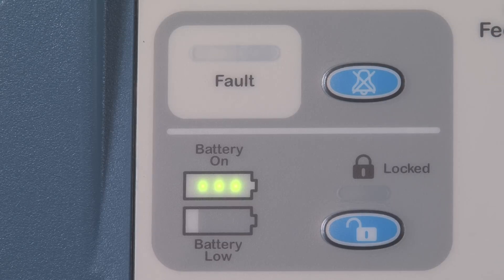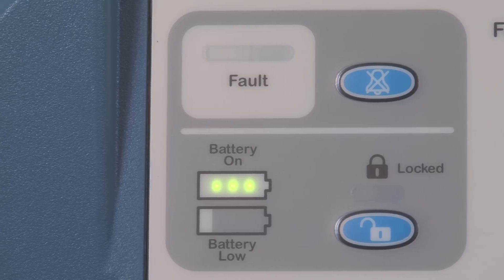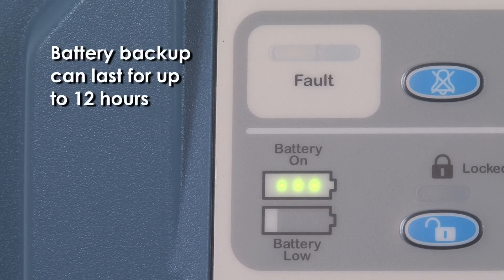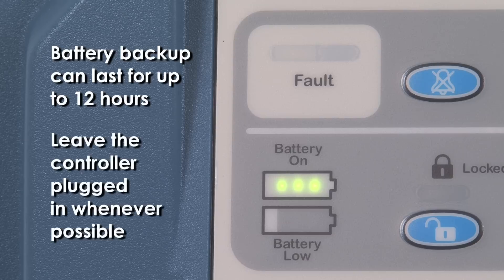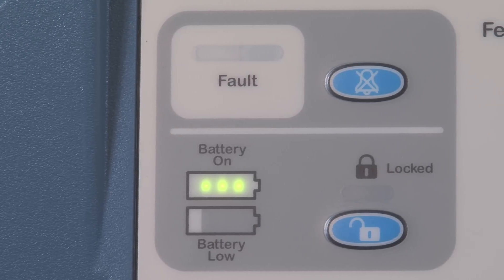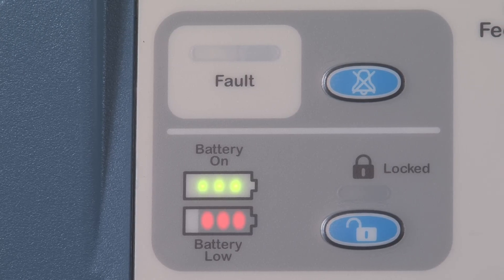The Dolphin features a battery backup system which provides active therapy to the patient when the system is unplugged from a power source. When under battery power, the battery indicator light will illuminate. The battery will hold a charge for up to 12 hours. However, the system should remain plugged in whenever possible to maximize battery life. The low battery indicator will illuminate when battery power is running low and when the controller should be plugged into an outlet.